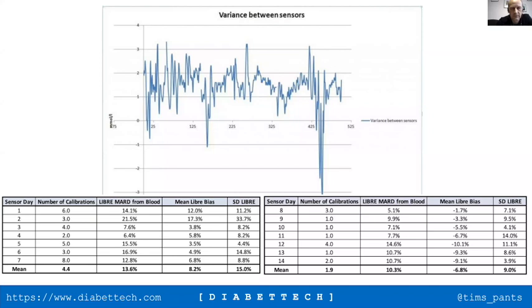Well, I think the smoothing is always on data in the past. Yeah, exactly. It's just about the algorithm. It's the same as with the delay you talk about, because in principle, the delay is always there. There's a difference between blood sugar and the measurement you do in skin. So all this technology is about improving the algorithm, but some delay is always there. For example, G6 is doing it really well. The algorithm predicts the CGM data in the future based on the data in the past, let's say 10 to 15 minutes, and Dexcom G6 is doing it really well.